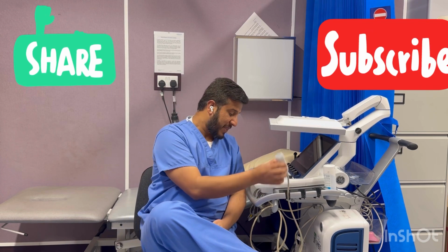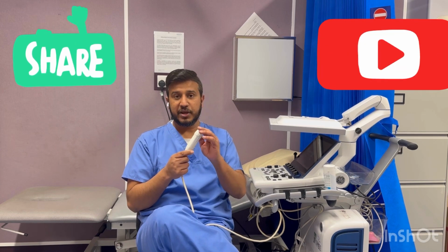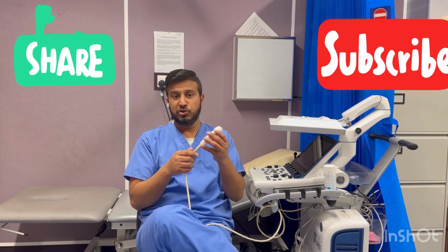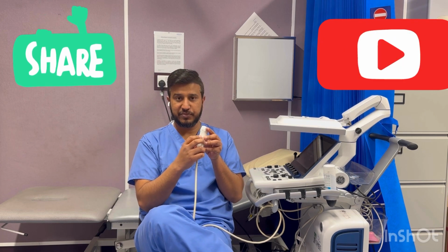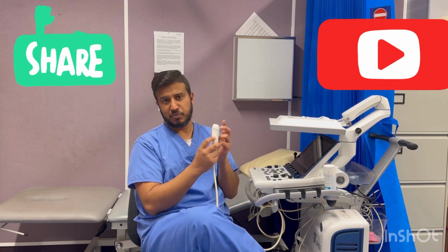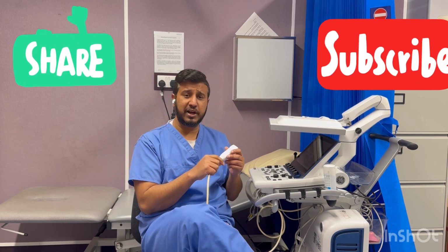So as I discussed in the last lessons, this is our probe, okay? This is the base of the probe, this is the tail, and this mark here, sometimes you see a light here, this is called the marker of the probe or eye of the probe. Someone calls it marker, someone calls it eye. So this is very important all through the imaging.